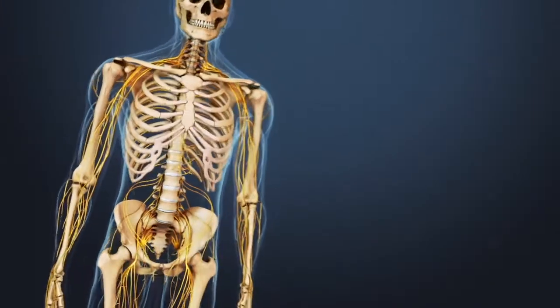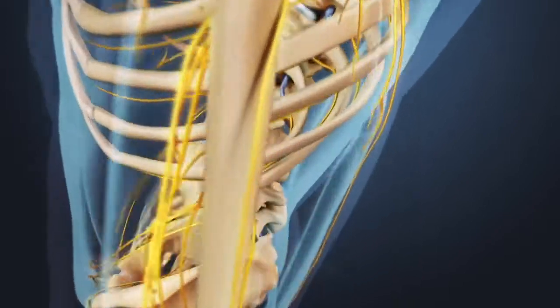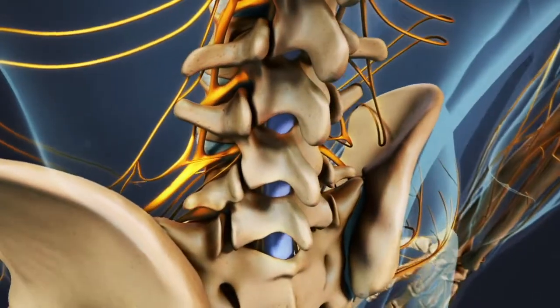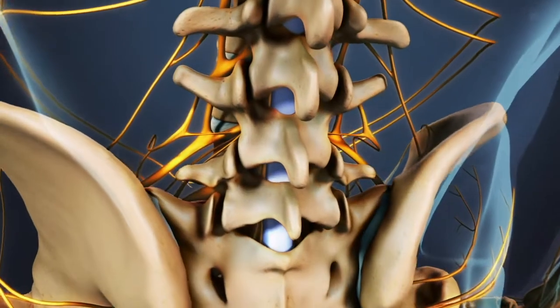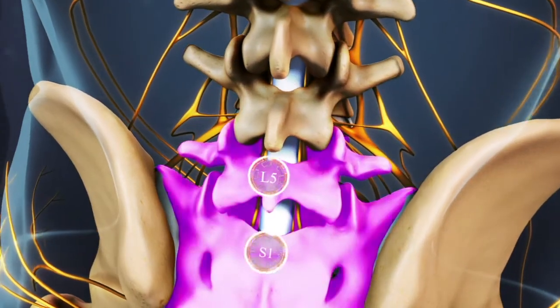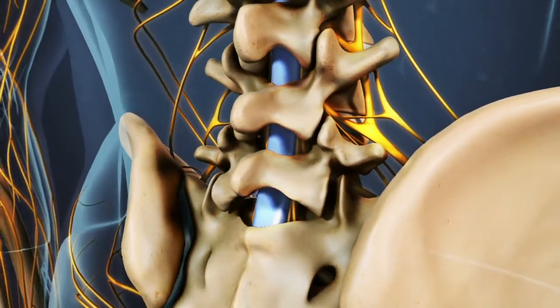An anterior lumbar interbody fusion, called an ALIF, is designed to stop the motion at the symptomatic segment of the spine. An ALIF is done in the lumbar or lower spine. Most commonly, it is performed on the L4 through L5 or L5 through S1 segment at the bottom of the lumbar spine, as these segments are most likely to break down.